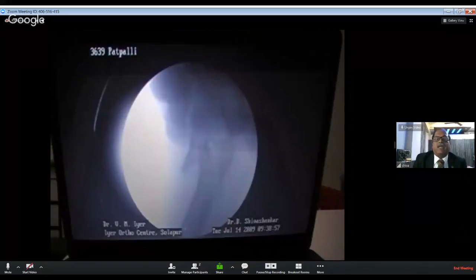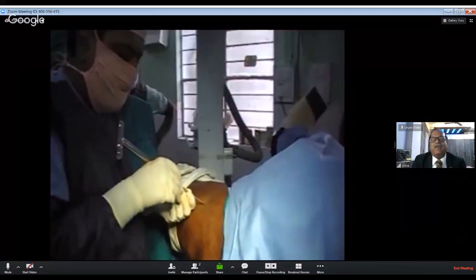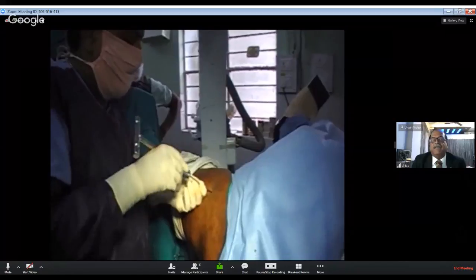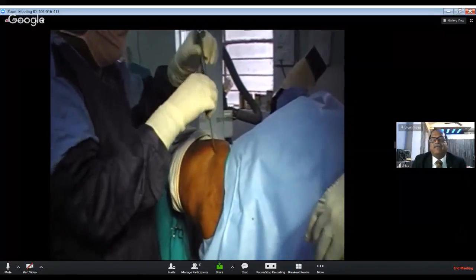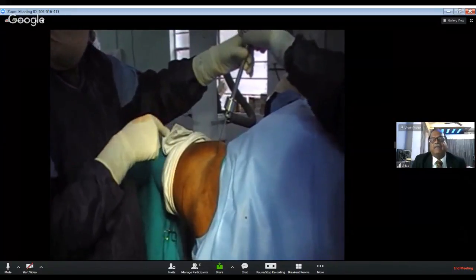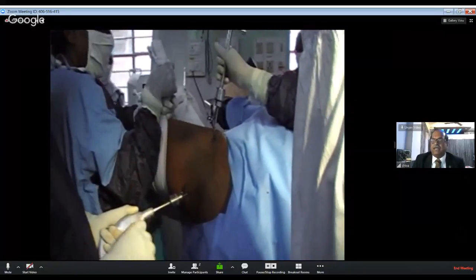And finally, what I did, see, I initially tried to lift the thigh with the towel, but the neck shaft angle was not becoming perfect. It was still getting angulated. So I passed the Steinman pin first in this fashion to the back side. I disengaged the fragment. I pushed the shaft out because it was a 15 days old fracture. Then the towel, you can see the assistant lifted the thigh of the shaft. Then I fixed the fracture immediately in this fashion.